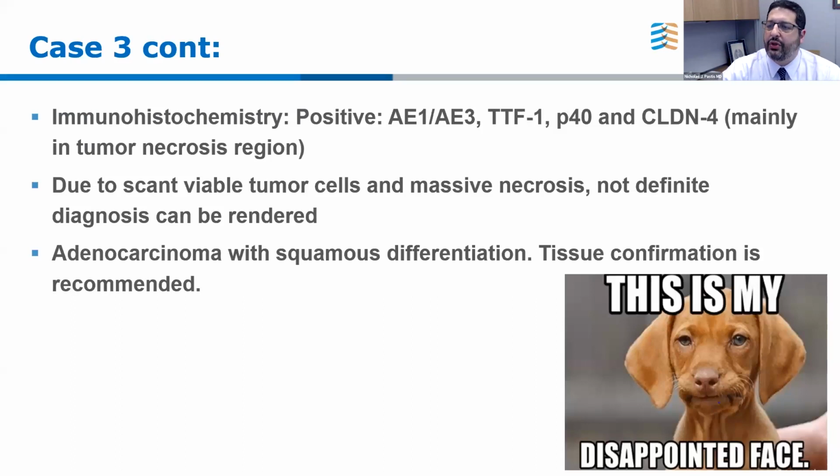So you can do an EBUS. You may try the pleural effusion as we talked about, but it was very small. Not all malignant effusions are always positive.